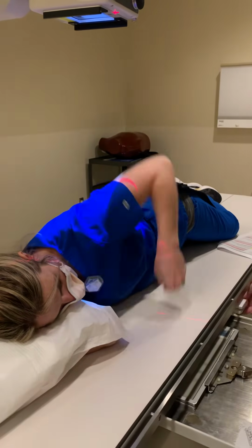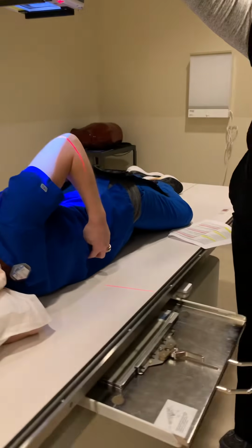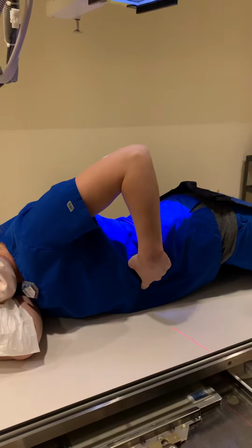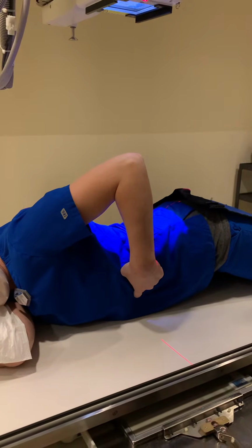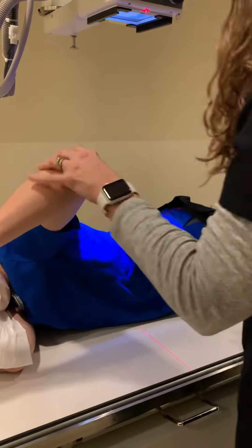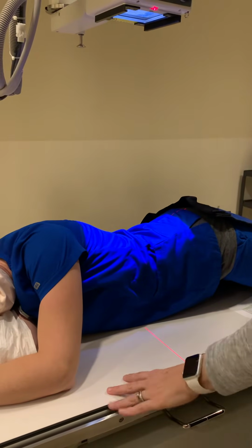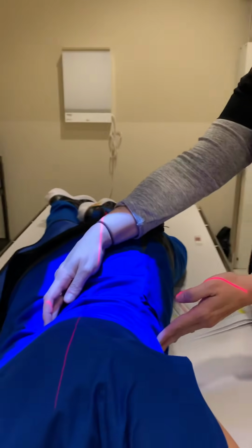We're going to rotate our patient approximately 45 degrees. Merrill says 40 to 70. It varies with patients, but for demonstration purposes, we're using about 45. Use center at L1, L2, which is the anterior curve of the ribs, or it can also be approximately 1 to 2 inches above the lower rib margin. Use center between the spine and the left lateral surface of the patient.